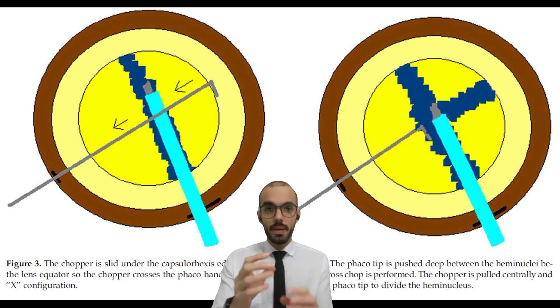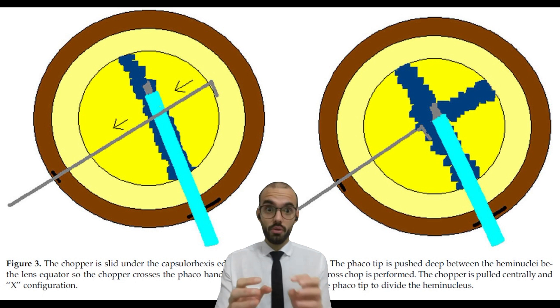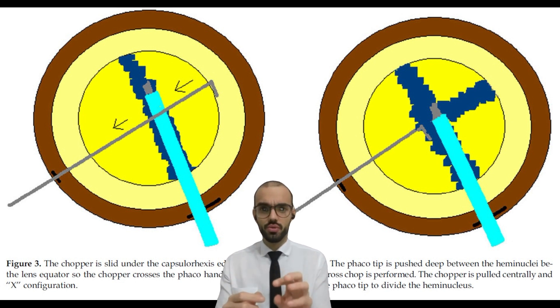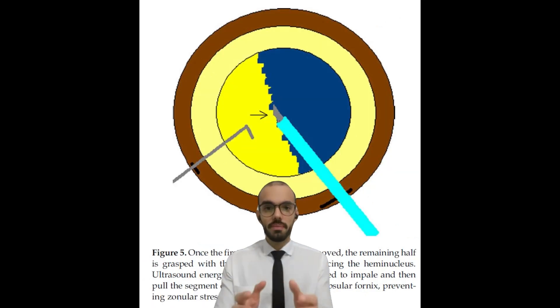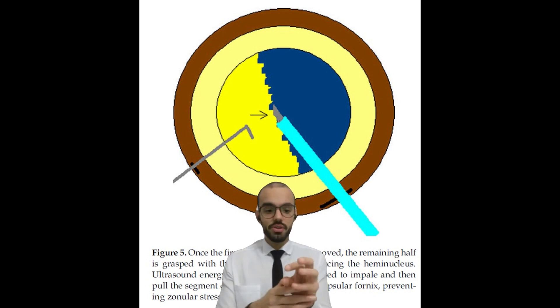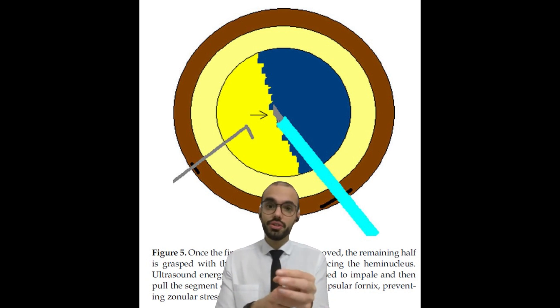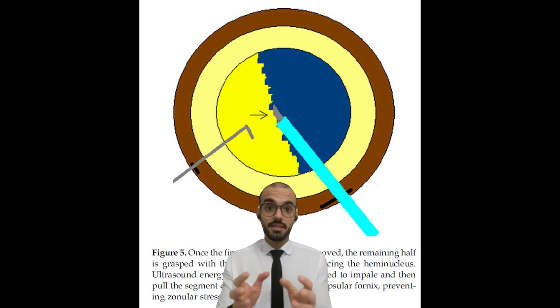The fourth step: with the two small pieces, you remove one of them using phaco without rotating the nucleus. You can use your chopper to bring the pieces near to your tip and remove them. After removing one piece, you are left with half of the nucleus. With your tip, you rotate it and place the opening of the tip near your remaining half piece, then remove and phacoemulsify it. That is the end of the Cross Chop technique.